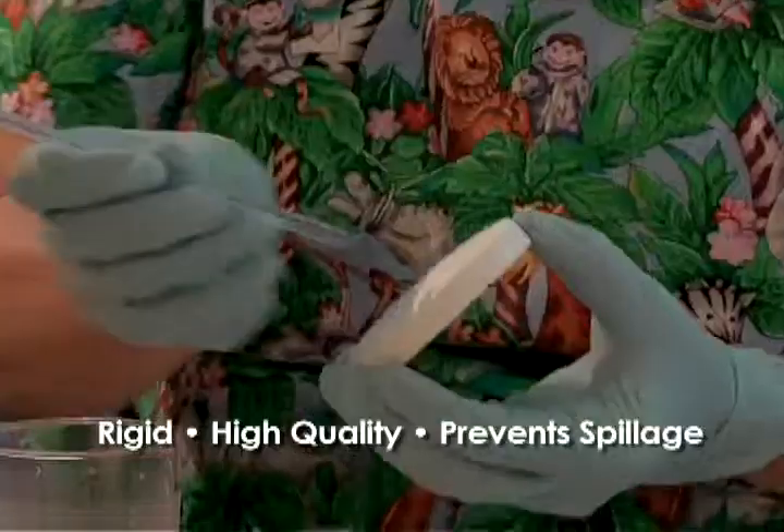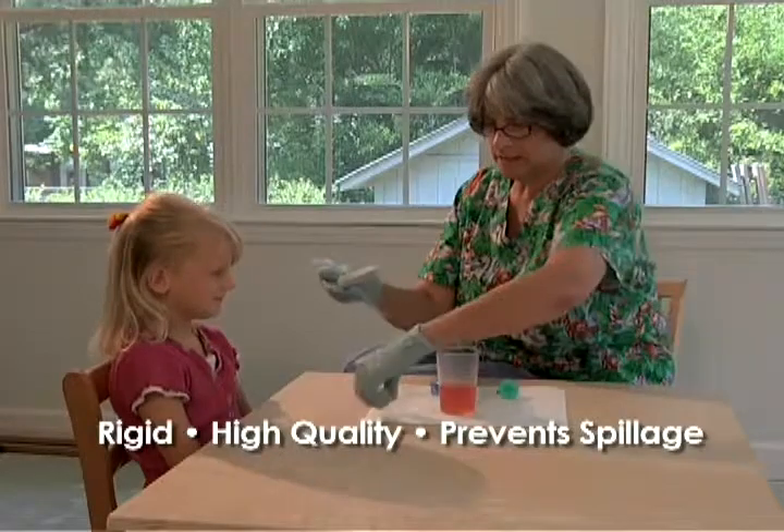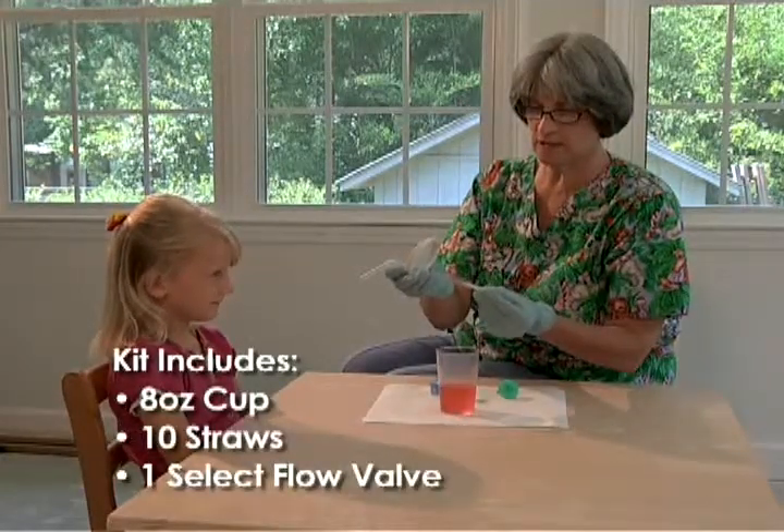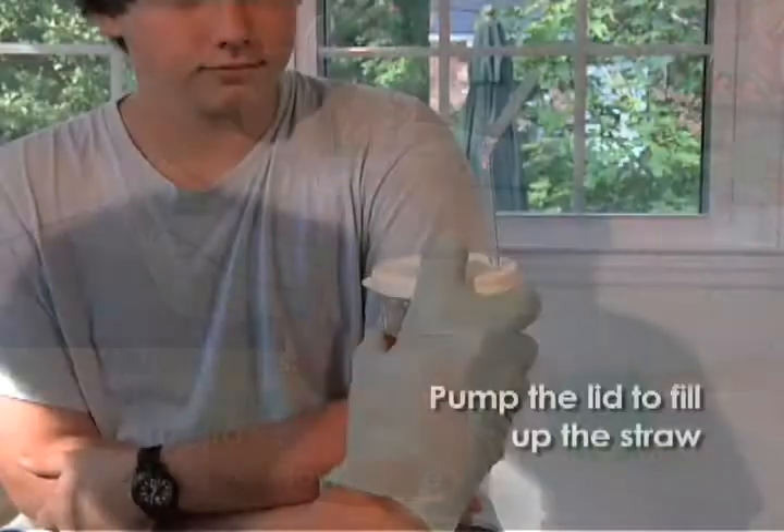The Sip Tip makes drinking easier. Included in the kit is a rigid high-quality graduated eight ounce tumbler. The lids snap on securely to the tumbler in order to minimize spillage, and the valve keeps the straw full of fluid to reduce coughing and choking.